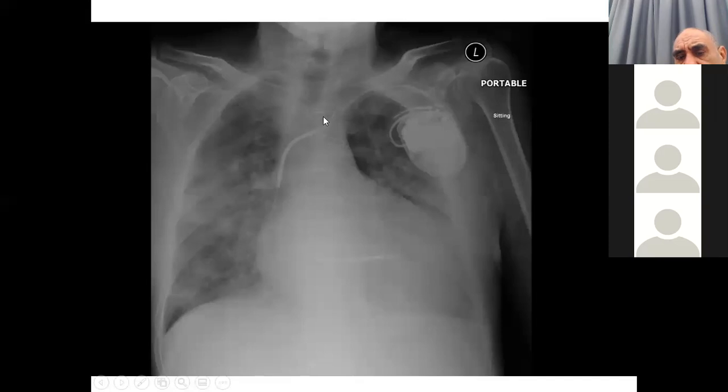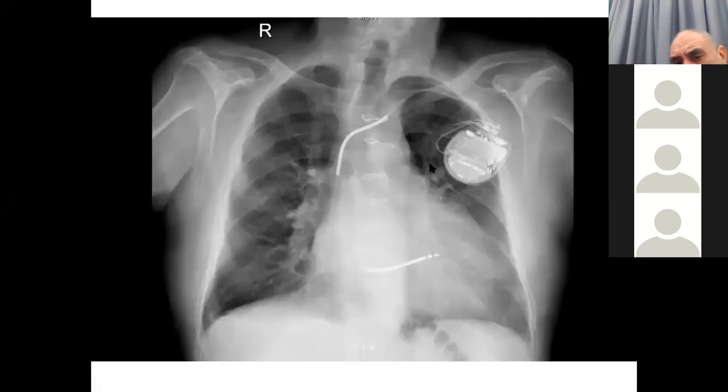He underwent coronary artery bypass graft surgery in 2004, and after a few years he received an ICD because his LV function was less than 30%. But then he started to develop pulmonary edema, and we found that he had developed atherosclerotic calcific degenerative aortic stenosis, for which he received the TAVI prosthesis.